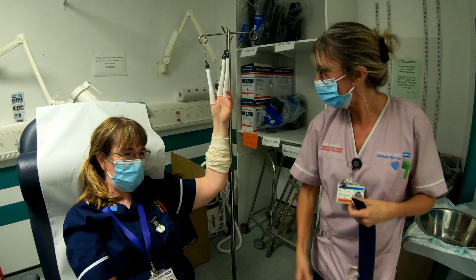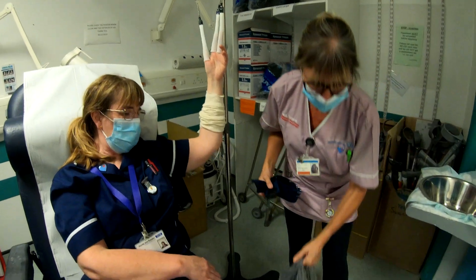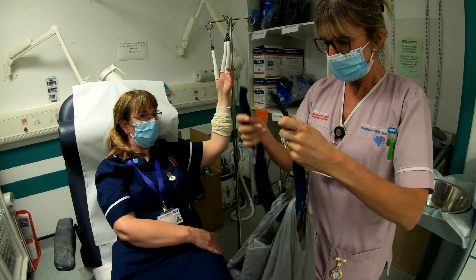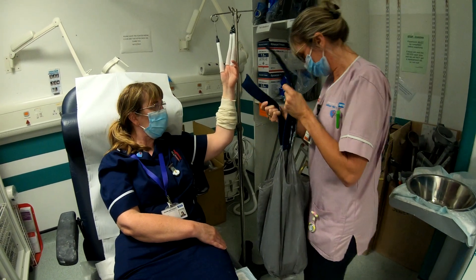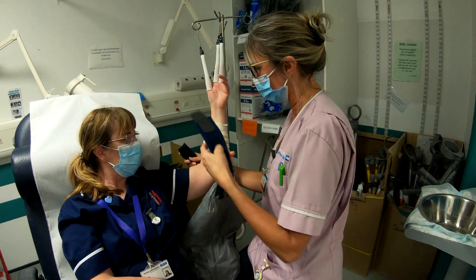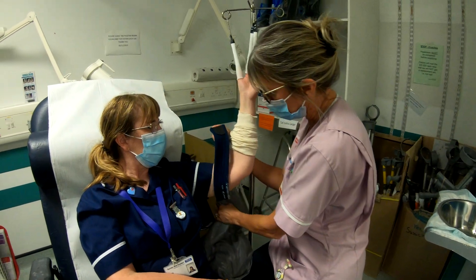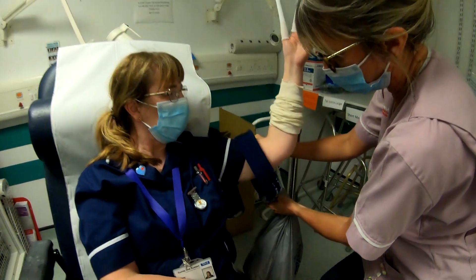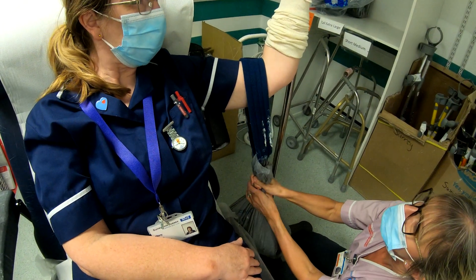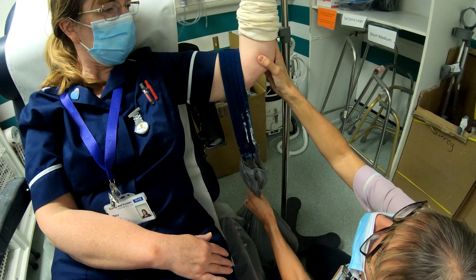We're now ready to put the weighted bag on. Thread the weight through the bag, and it's easier with two people — pop this round her arm and slowly let the weights go so it's not too much of a shock. Just gently increase the weight, making sure the patient feels comfortable.